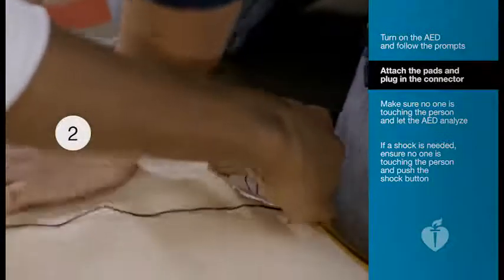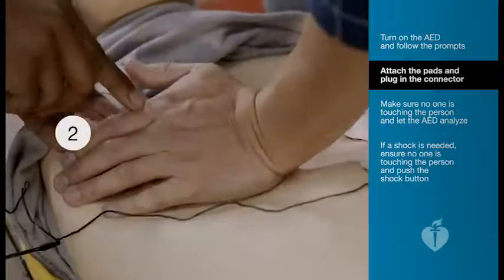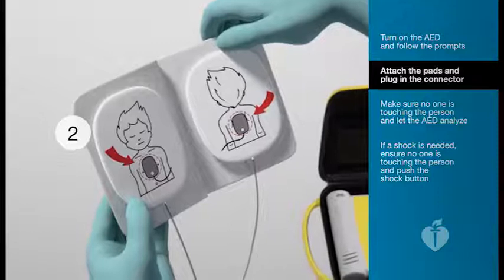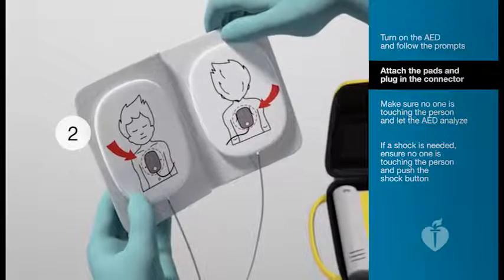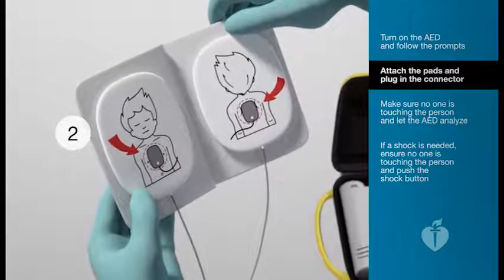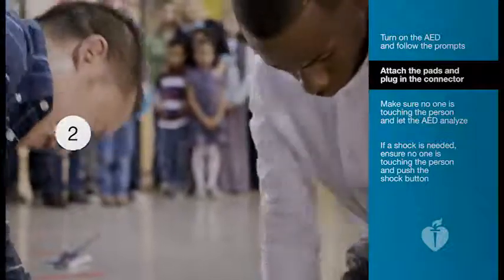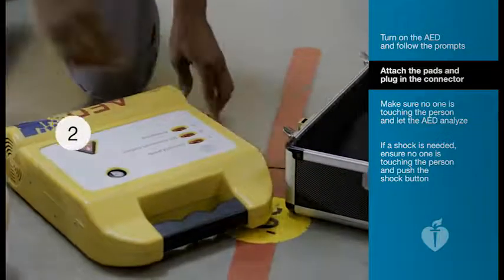When you put the pads on the chest, make sure they don't touch each other. If a child is very small, you may need to put one pad on the child's chest and the other on the child's back. When in doubt, follow the pictures on the package or pads. Attach the pads and the AED will tell you to plug in the connector.